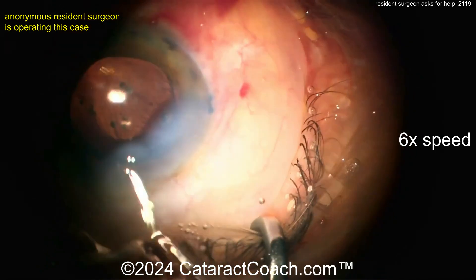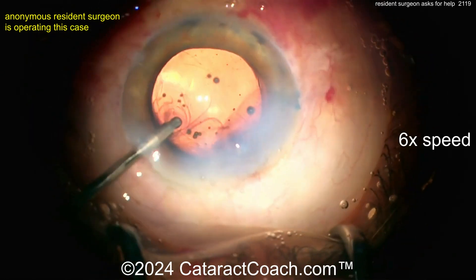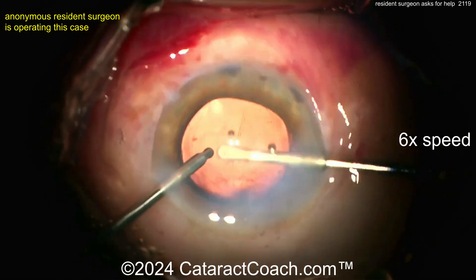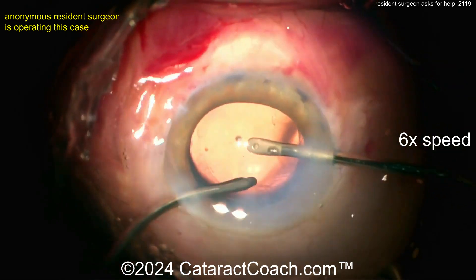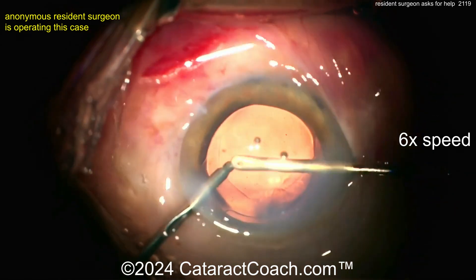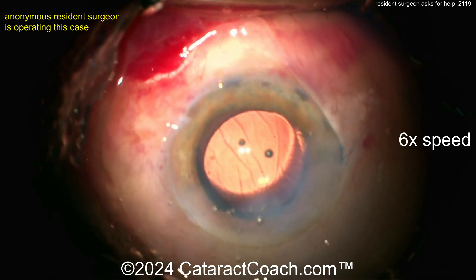And now the hydration. Enough with the hydration — you're coming to the central visual axis here with the hydration, that's too much. Now manual IA to remove the viscoelastic. I want to encourage you — you have good hands, you just need to get back to the basics. Let's start from step one. Go through the curriculum series; if you say you already did it, do it again. Start at video one, go through all 25 parts of the curriculum series, and I promise you, you'll learn a lot.